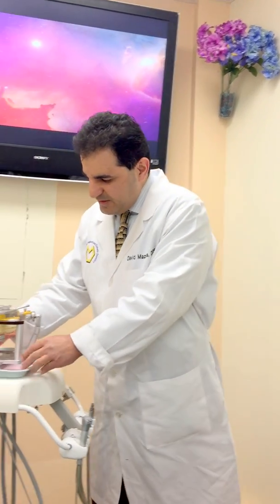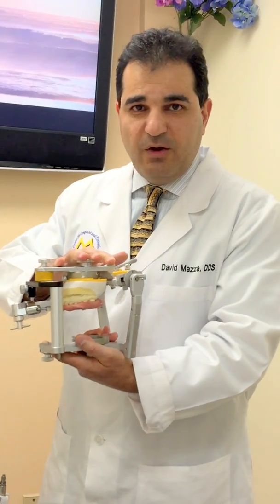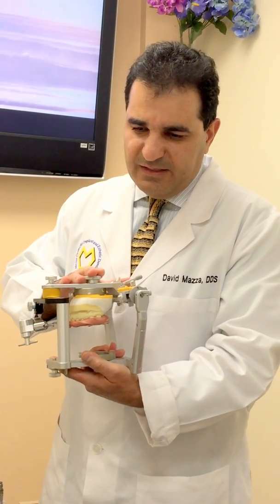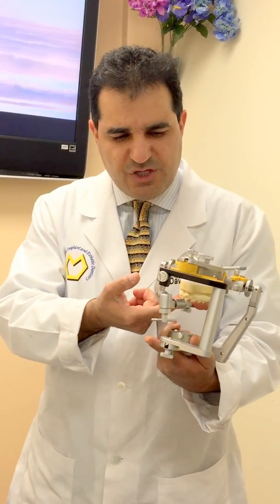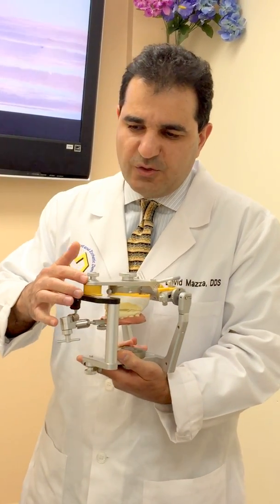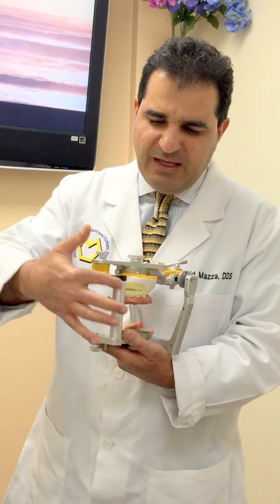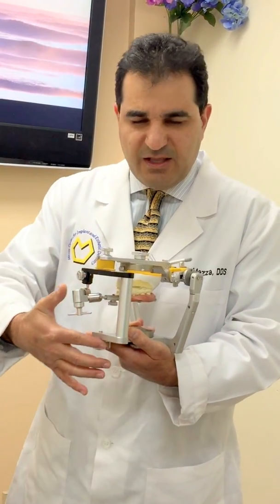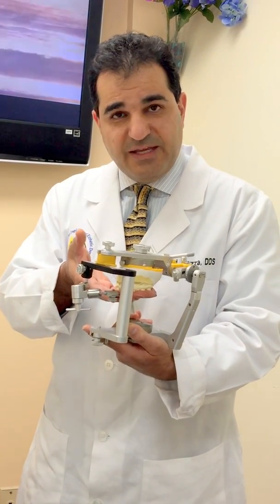As you can see on this case, the maxillary cast is already mounted on the SAM III articulator using an axiomatic transfer assembly jig — that is the U-shaped fork — and also an axioquick transfer fork articulator assembly, which is going to be acting like a lever to establish good support for the maxillary cast to be mounted.